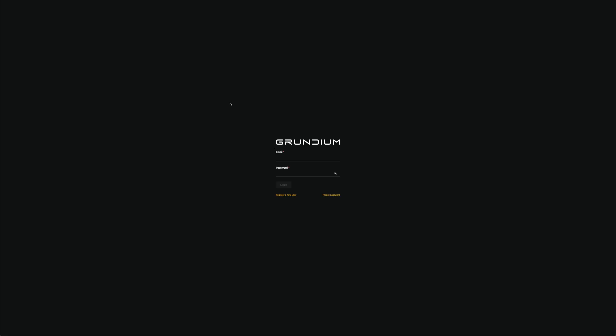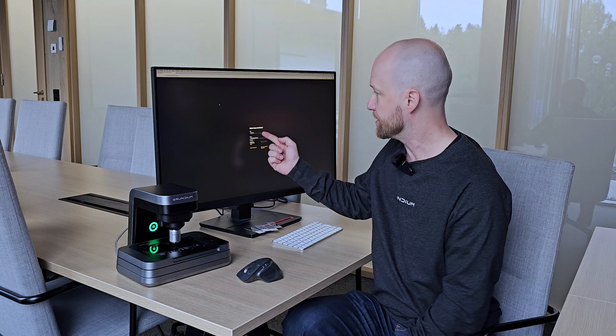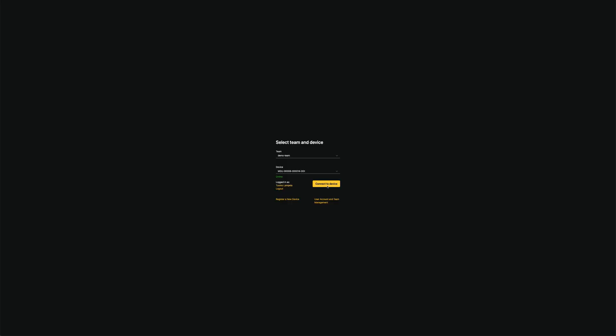So we can just log in using our credentials, and then we can choose the team and the device we want to use. This is exactly the device that I'm going to use today, so I'll just click connect the device. And that opens up the scanner user interface in the microscope mode.